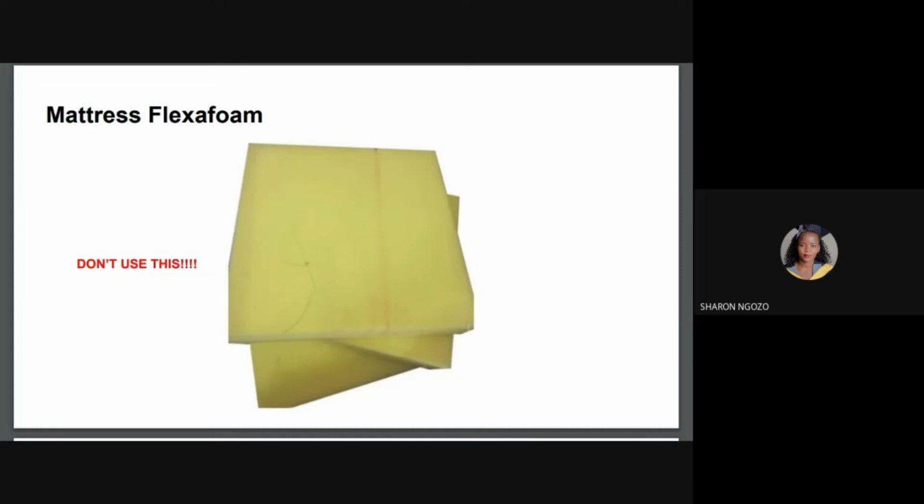So this will also give room for easy airflow to the compressor. So if you have replaced the gross particle filter with gauze bandage, you have to remember to change the gauze at least every week, so that you are putting on a new gauze, so that you don't have a dirty gauze, as that can even affect the performance of the concentrator.